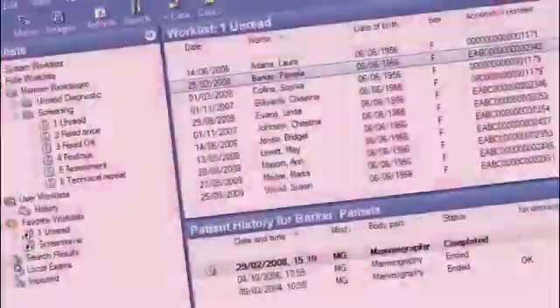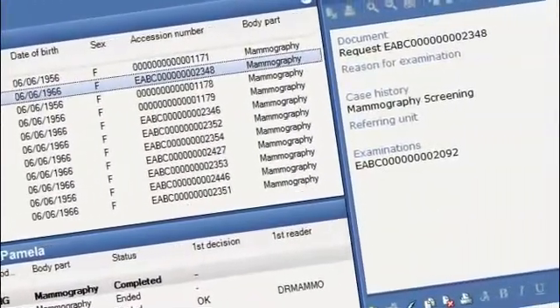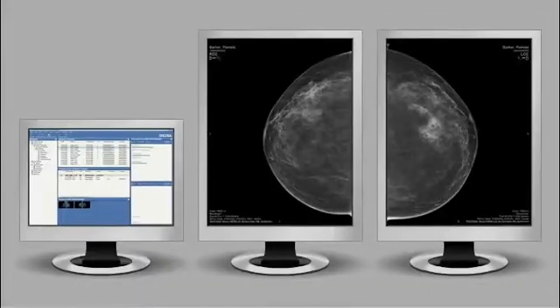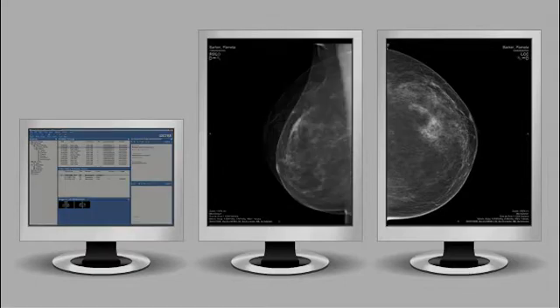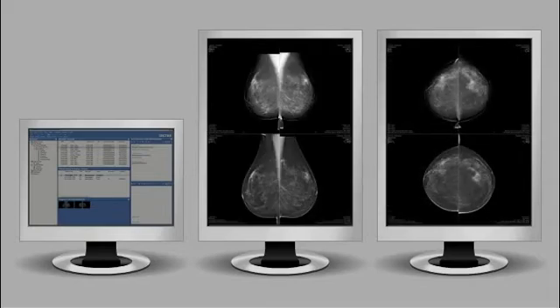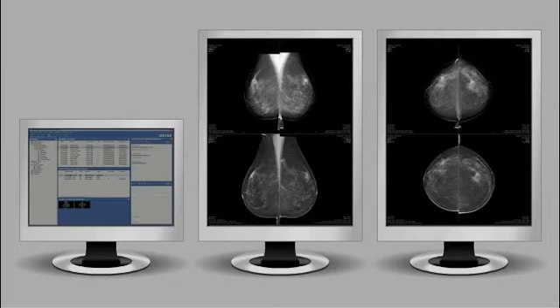For a start, you have immediate access to worklists that change dynamically according to your workflow. It's easy to find and organize the information you need, and to not disturb your eye during reading, the information window automatically dims when you move the cursor over to view images. All digital breast images, regardless of modality vendor, are automatically displayed in the same size with correct orientation and alignment, allowing easy comparison of current and prior images.